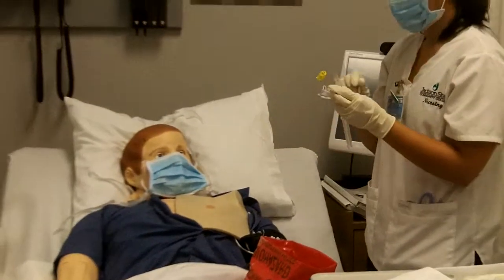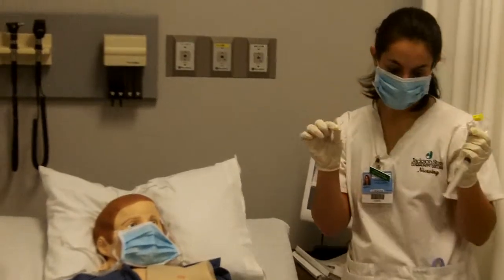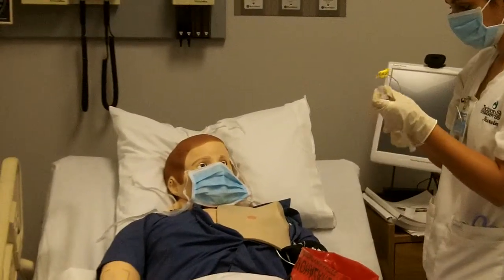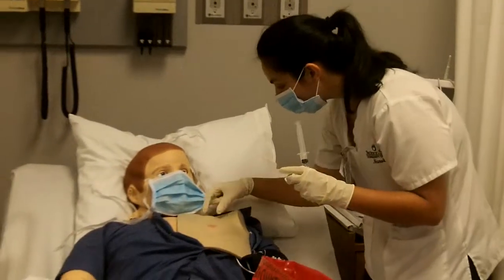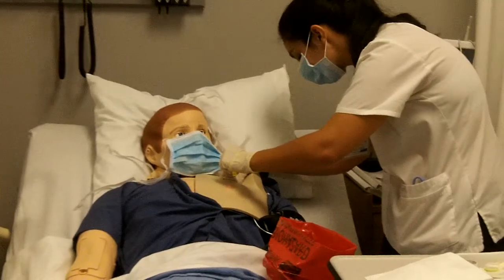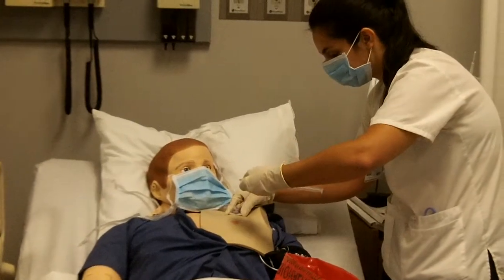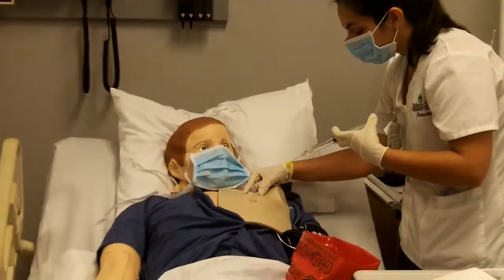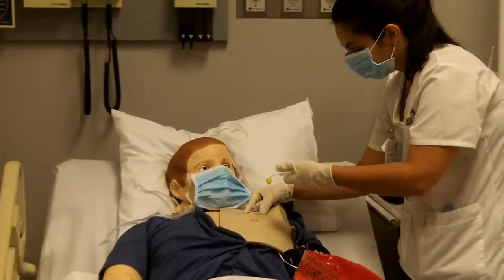Okay, and now my chlorhexidine has dried. I'm going to remove the cap over my Huber needle. And I'm going to insert it at a 90-degree angle. Let the patient know he's going to feel a stick. I unclamp my Huber, I aspirate for blood. I do have blood return. I'm going to push the 10 milliliters of normal saline. I'm going to clamp.